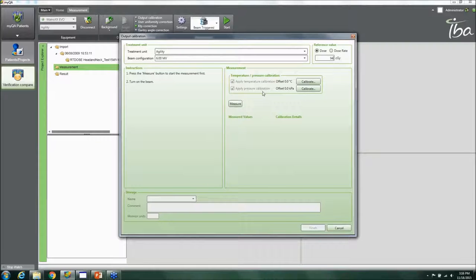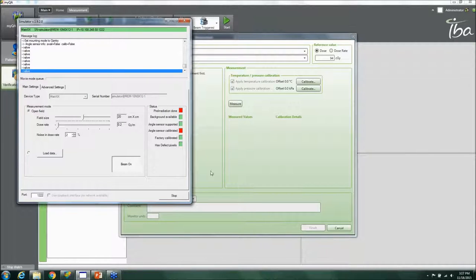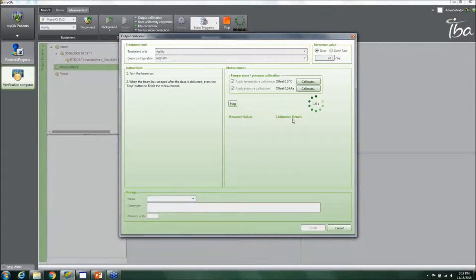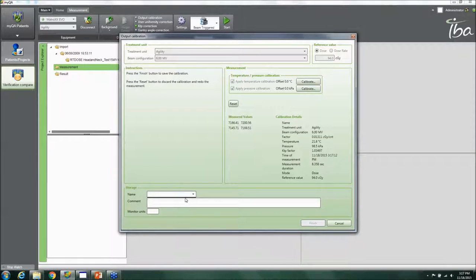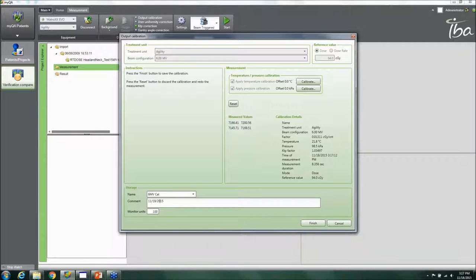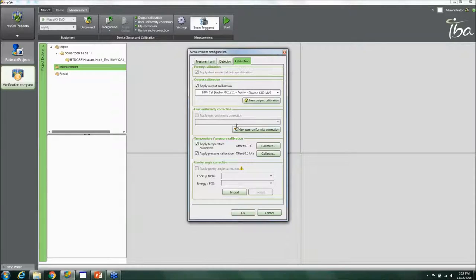You can apply a temperature calibration to the detector, then use the simulator to deliver beam. After delivering the monitor units, click Stop and give the calibration a name — for example, '6MV Cal' — enter the number of monitor units delivered, the known dose in cGy, and add a comment with today's date. Click Finish and the calibration is applied to your measurements.